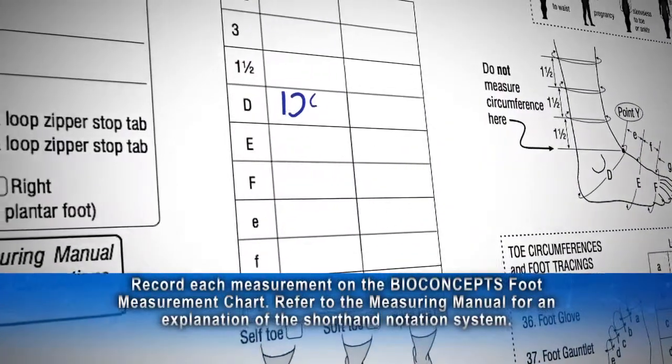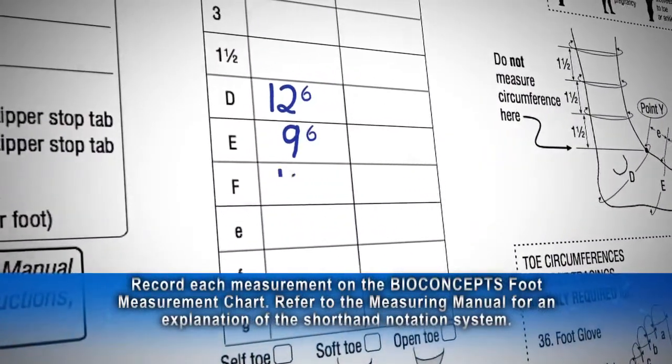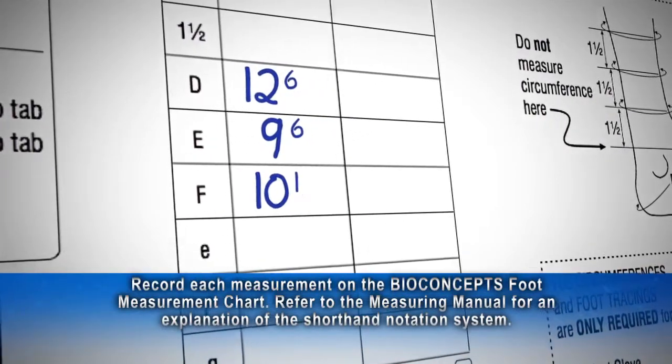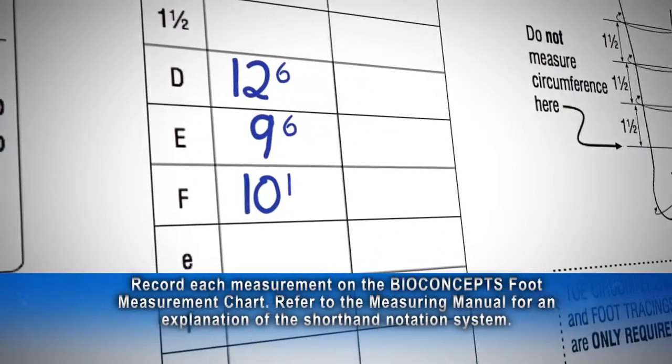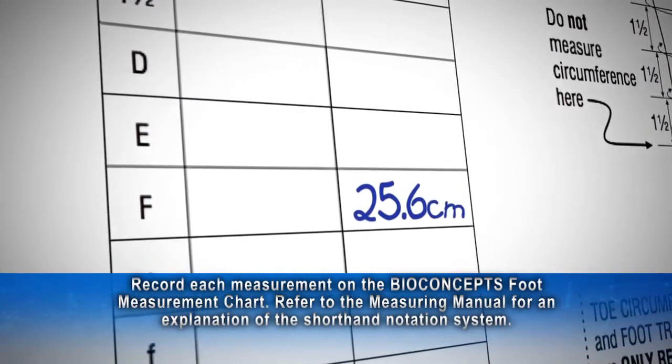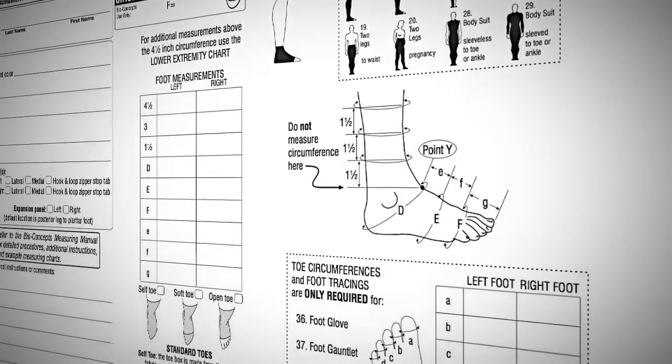Record each measurement on the BioConcept's foot measurement chart. Refer to the manual for an explanation of the shorthand notation system for measurements recorded in inches. Measurements in centimeters are welcome. Simply record in decimal notation. Know the measurements you need before you start measuring.